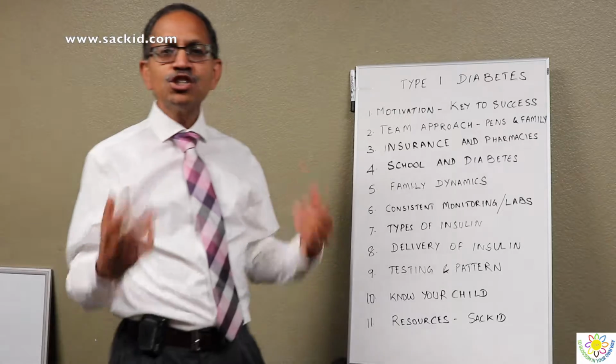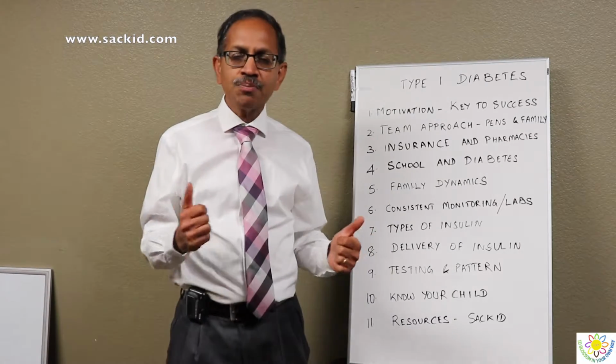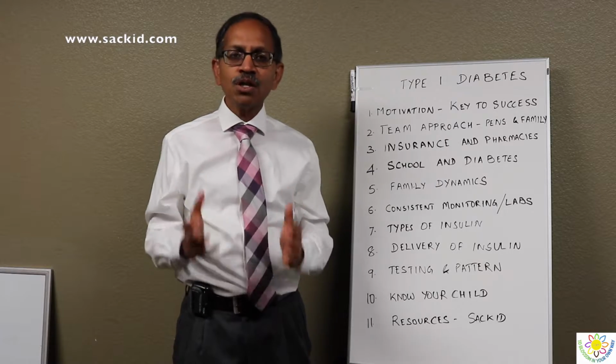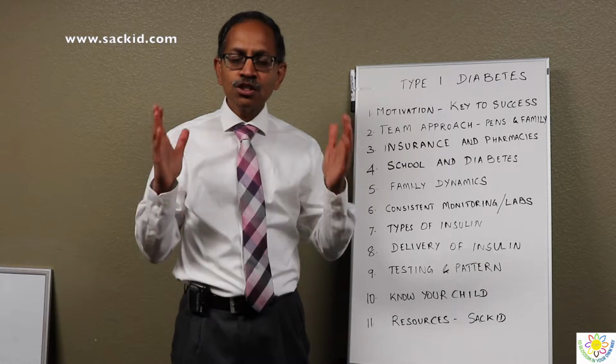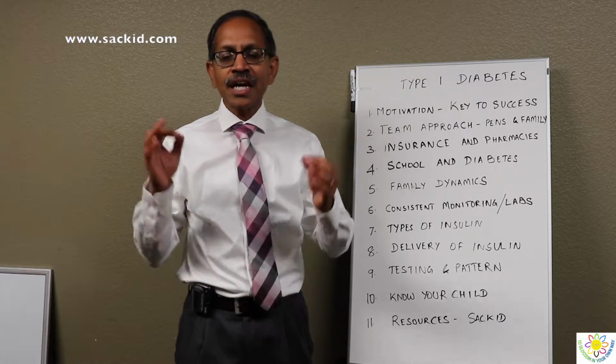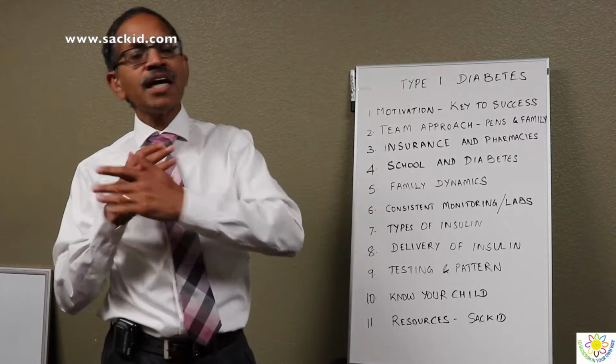Next, we talk about insulin delivery. When you leave the hospital, typically you leave with an insulin and a syringe. And that is because that's a basic skill set you and your child have to learn. Insulin syringes and needles are going to be available anywhere in the world.